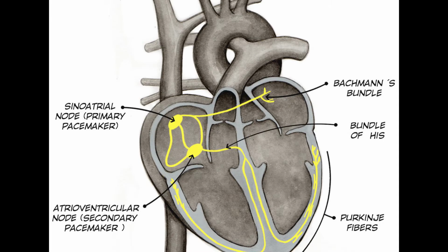During a normal heartbeat, a healthy heart has an orderly progression of depolarization, which starts at the pacemaker cells in the SA node. It spreads throughout the atrium and passes into the AV node, down to the bundle of His, into the Purkinje fibers, and spreading throughout all the ventricles. This orderly pattern of depolarization gives rise to the characteristic ECG tracing.